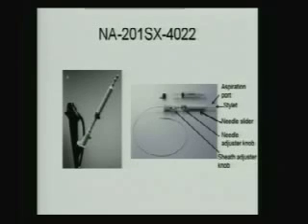The needle apparatus for biopsy was specially developed for this purpose. It's a single-use needle, and it has many features to help with the procedure. You have a sheath adjuster knob here. You have a sheath slider, and then you have a needle adjuster knob, a needle slider, and a stylet. The stylet is very important. It obstructs the needle while going through the wall to biopsy the lymph node, so that bronchial and tracheal tissue doesn't occlude it and fill it and contaminate the sample.